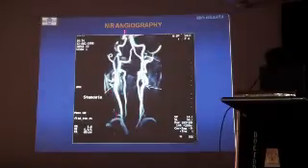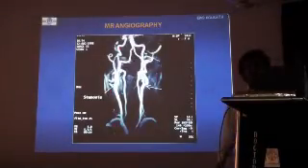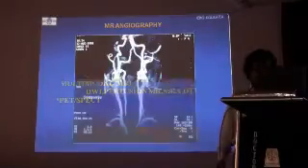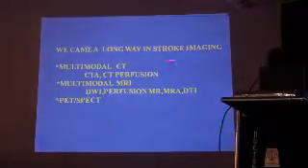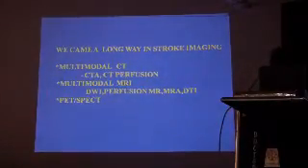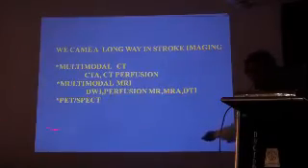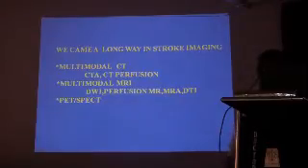Similarly, MRI angio, as I have told you, is almost non-invasive, and sometimes to see the neck vessels you may not require any contrast. If you give contrast, the resolution will be better. Now, we have come a long way in stroke imaging: multimodal CT, CT angio, CT perfusion, multimodal MR, diffusion, perfusion MR, MR angio, diffusion tensor imaging. Now we have PET, positron emission tomography, and SPECT, single photon emission computed tomography.